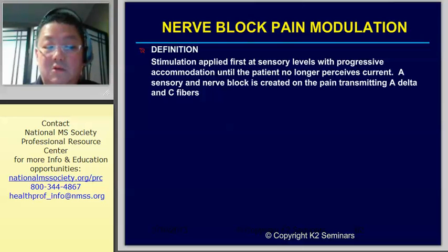Another way to do it is through reciprocal inhibition. So turning on the antagonist to turn off the agonist. So if you're having a lot of spasticity occurring in the hamstrings, being able to turn on your quads using this technique might be another way to look at it.